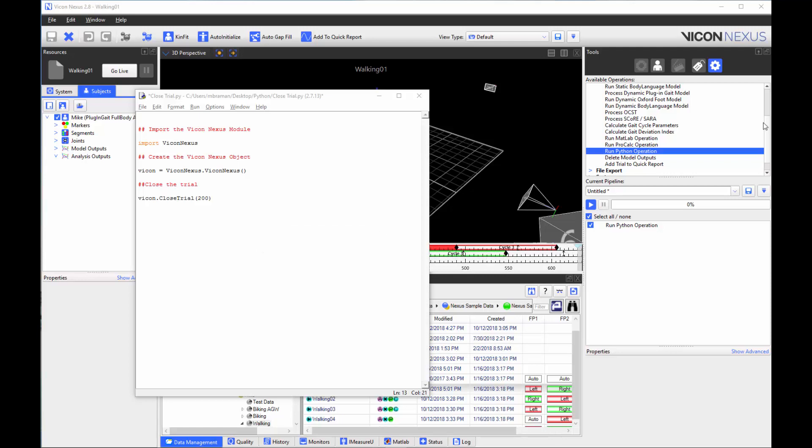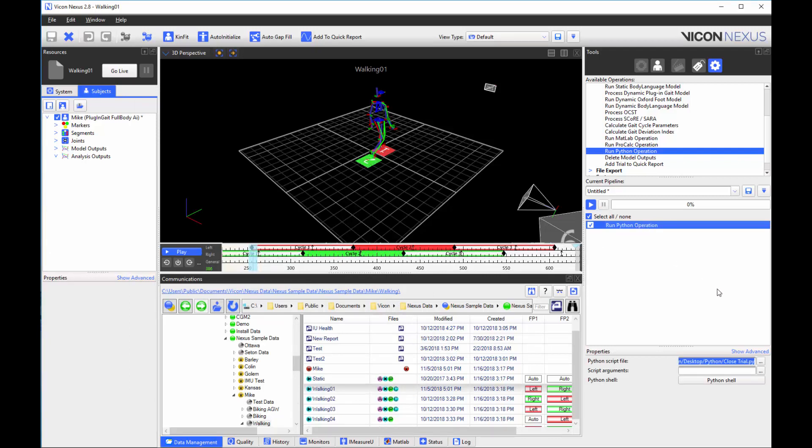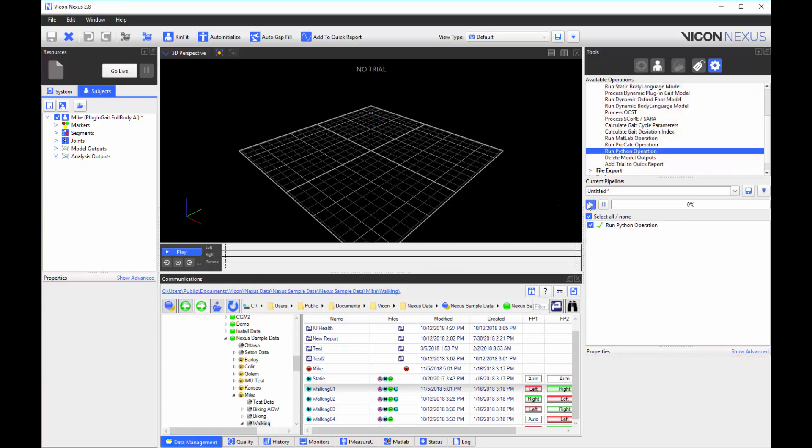Here is an example of a Python script with the close trial command at the end. I can run this script using a pipeline I have already created in the run Python operation where I have specified the location of the script. You can see the trial has now been closed.